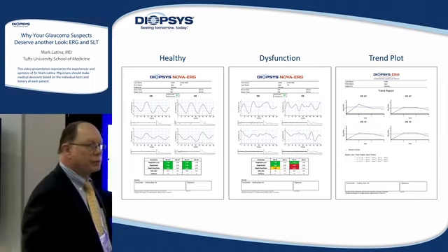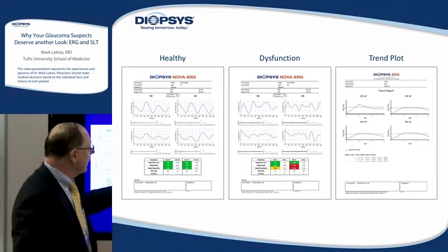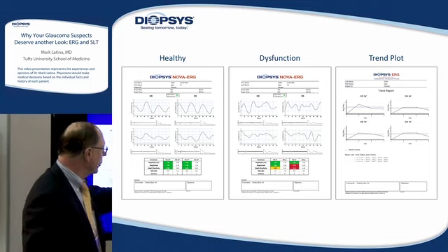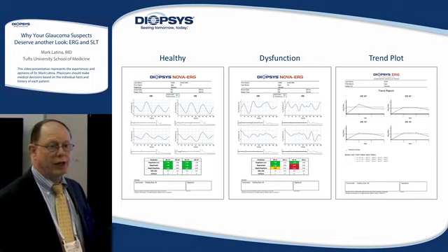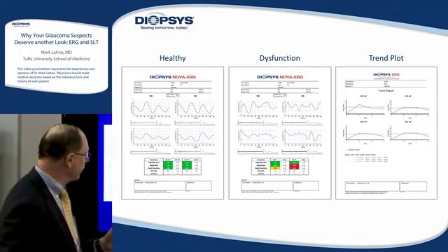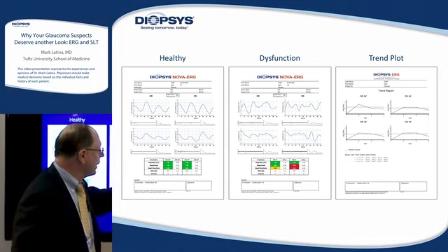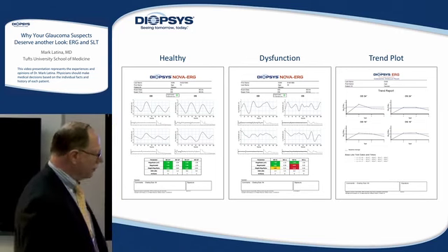As the cells begin to become less viable, or you can say begin to suffer, their intrinsic variability decreases, and what you see is a change in the waveform shown here, and likewise a change in the magnitude. In other words, the number of cells which are actually producing the electrical output, as well as how well they're in sync. So we see these changes here. And then after a certain number of tests, you can follow changes in the magnitude or magnitude D with a trend analysis.